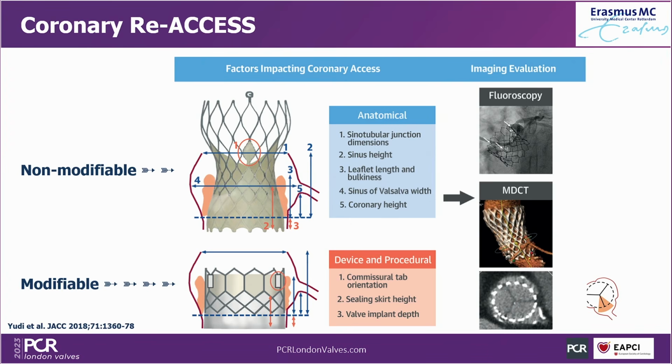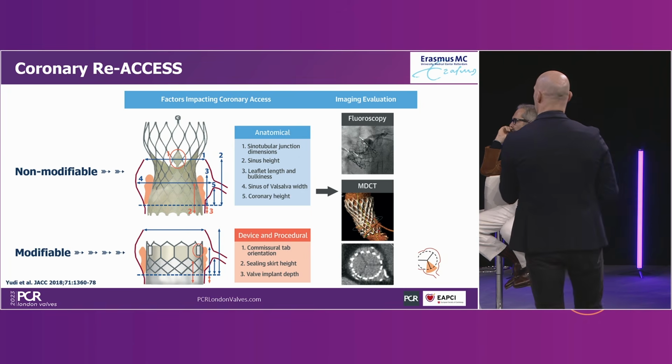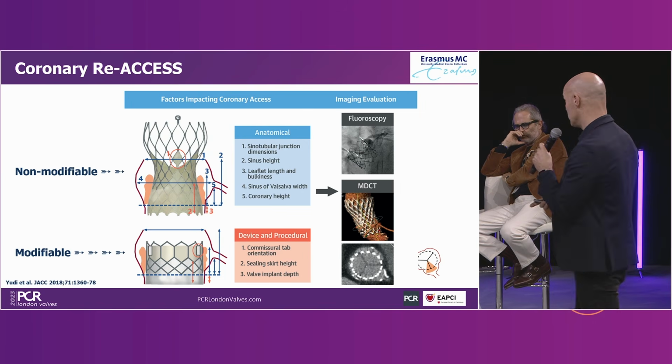An important aspect of contemporary TAVI is commissural alignment, and I'm not going to dwell too much on that. Fadi is going to discuss that in more detail, but it is an aspect that we need to master, and it's different for each valve platform that you're using.